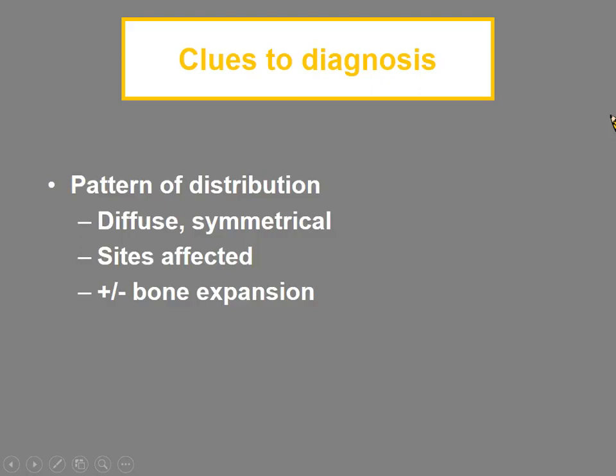As I've shown, they occur in a very organized manner, beginning first in the spine and then progressing onto the pelvis and then the proximal aspects of the long bone. So if you see abnormal marrow changes, say in the long bone, but you don't see those changes in the spine, it is quite unlikely that this is a disorder of marrow reconversion.